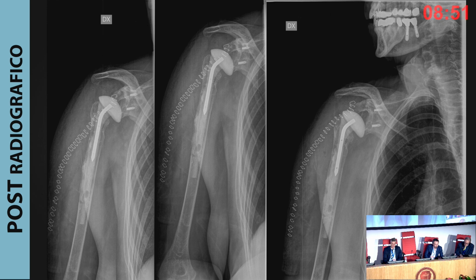I would not pursue removing those screws, and I may have. I would probably be happier if there was not such an amount of cement distally. But I've been in this situation, and I've seen X-rays of my cases like this. So let's hope for the best for this part. But regarding the spacer, this one looks great. I just use a small amount of cement proximally with methylene blue, so when I remove it, it's easy.